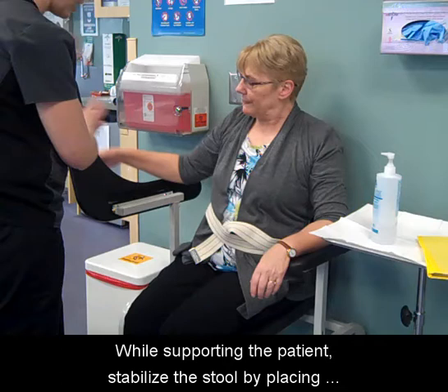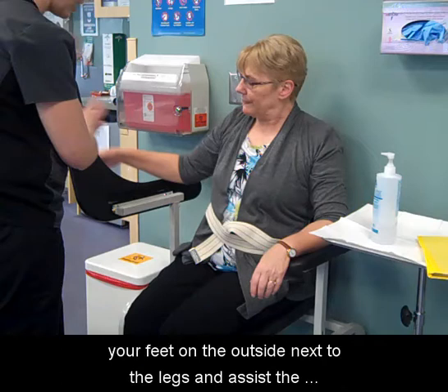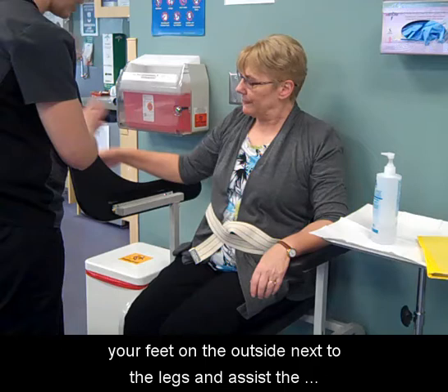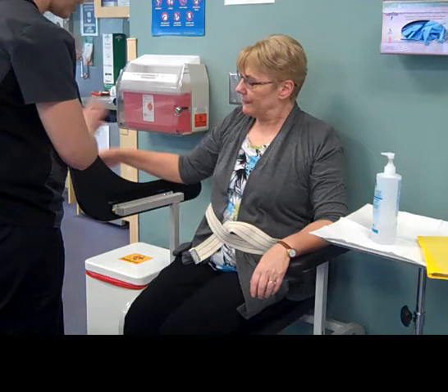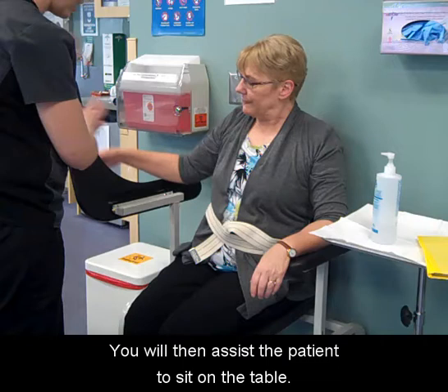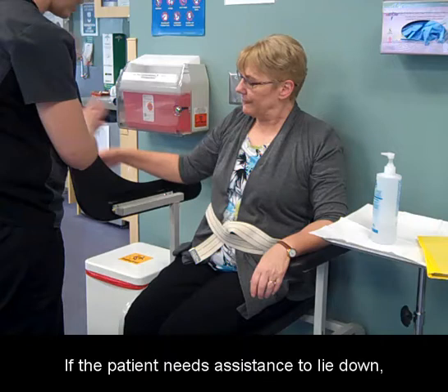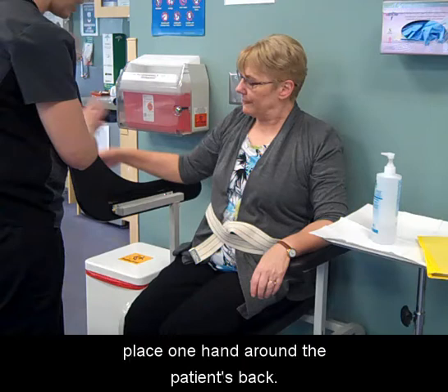While supporting the patient, stabilize the stool by placing your feet on the outside next to the legs and assist the patient to step onto the stool. You will then assist the patient to sit on the table.